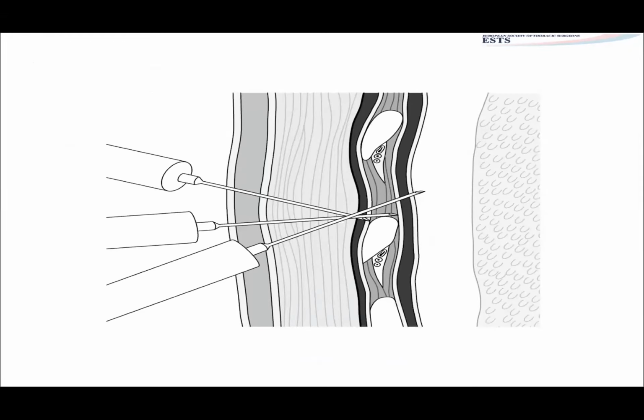Okay, the point is this is a very important picture. Okay, that shows you it's very important that you inject your local anesthetic through all layers from the pleura up to the skin. Okay, so you just start giving the local anesthetic in the skin, then you can advance it until you feel the upper border of the rib that you are going to insert the chest tube in the corresponding space.